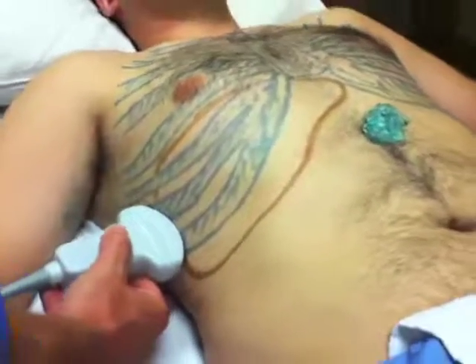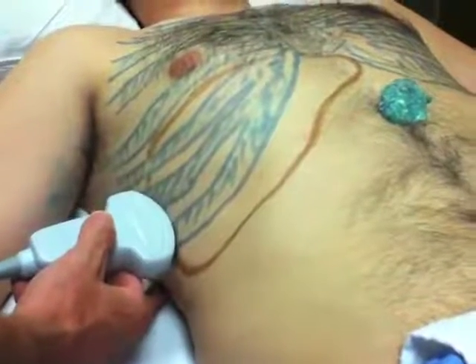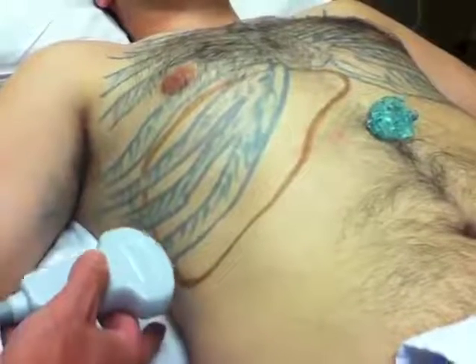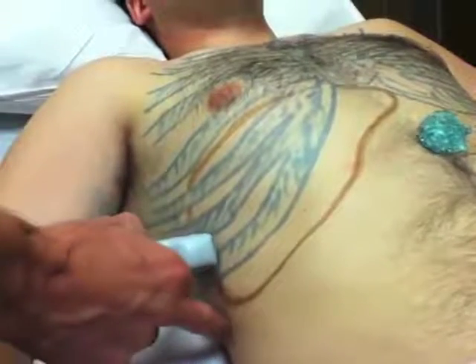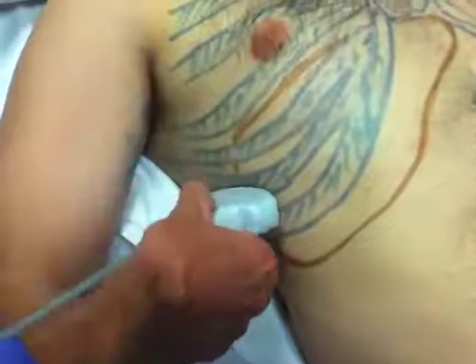Start in the right upper quadrant. Start with the probe horizontal, mid-axillary line near the lower ribs. If you don't see anything, move the probe more cephalad or caudad until you see liver. Once you see liver, you can oblique the probe to maximize your window in between the ribs. From here, you can rock the probe up or down, left or right, until you see what you're looking for.